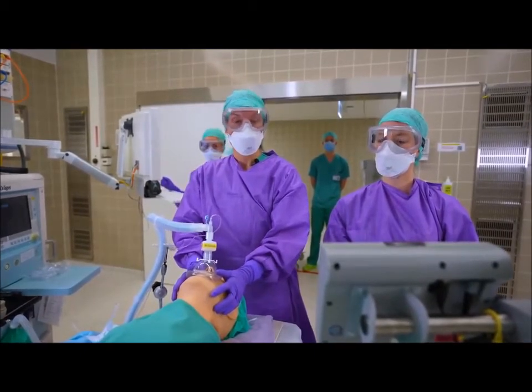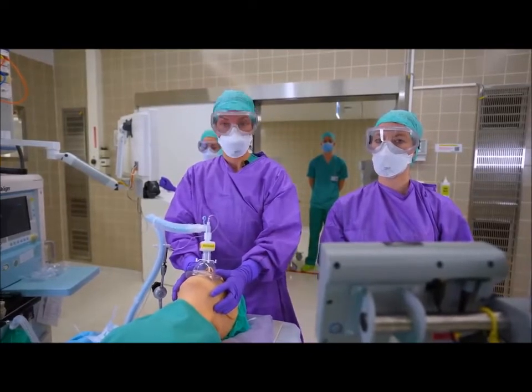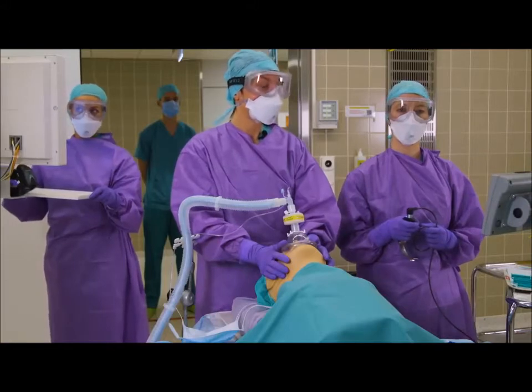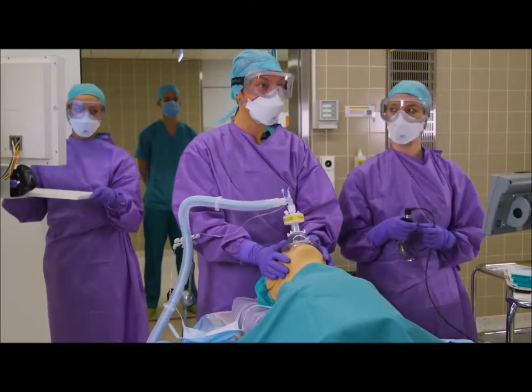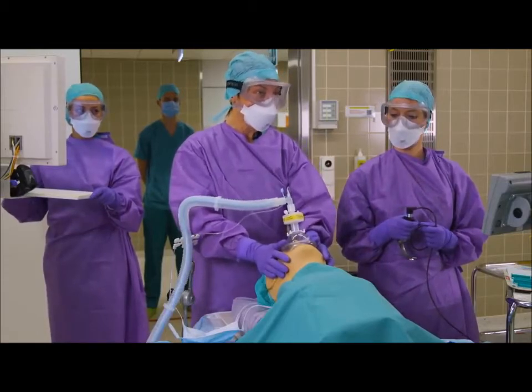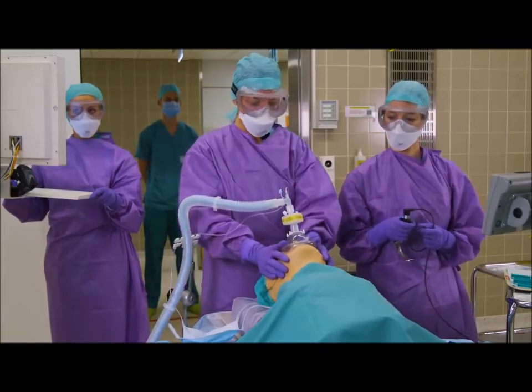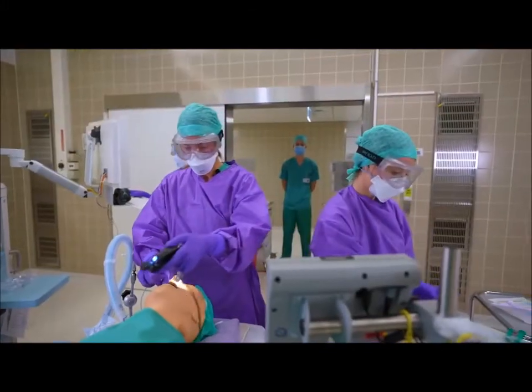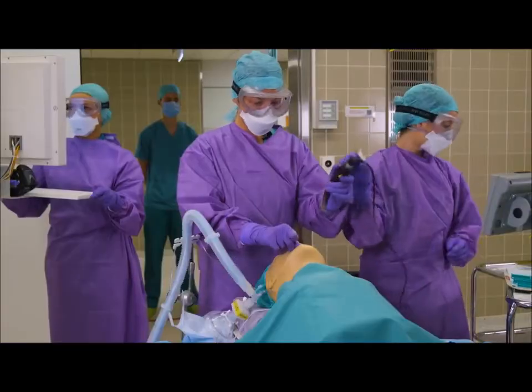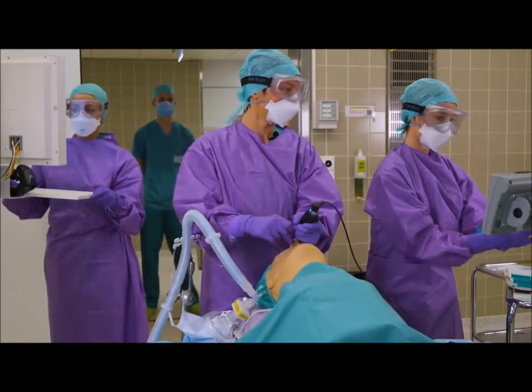RSI is used to avoid bag-masking the patient for prevention of aerosolization. Here, avoiding coughing with a thorough relaxation is also of utmost importance. We induce the patient and our patient is paralyzed. We are now intubating the patient with a video laryngoscope. We are utilizing an endotracheal tube with a stylet in place.